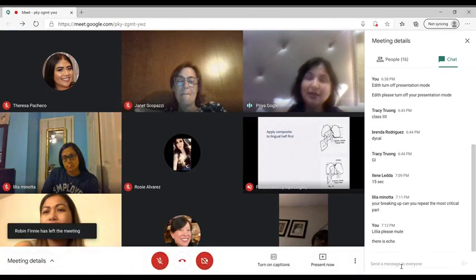So look at the patient's tooth and decide whether you want to use a light or dark translucent. I have used light translucent. I feel like the light translucent is very light and it has given me a lot of gray color in the tooth. So I've not been very happy with that. The dark translucent is, I think, better.